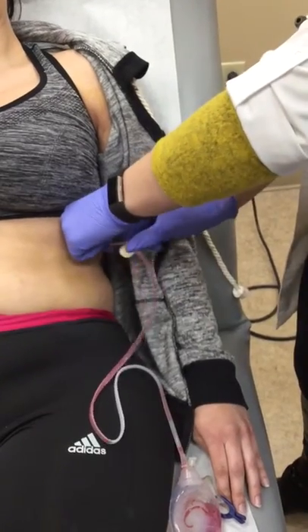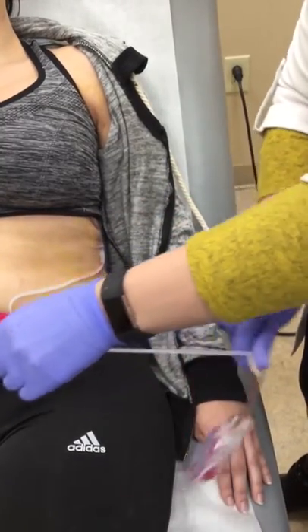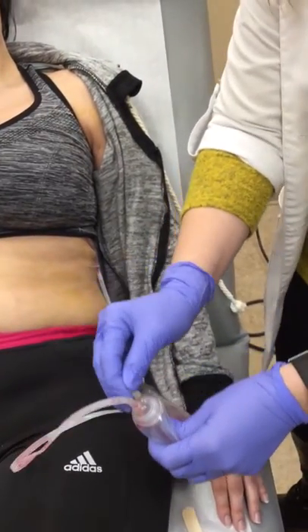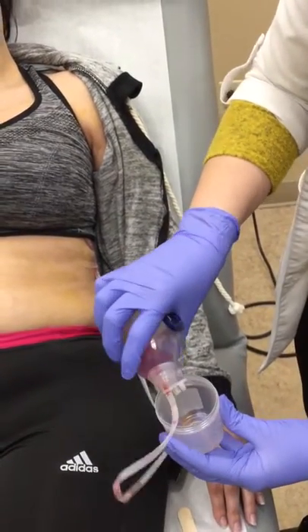I'll do that one more time. Now what you want to do is open the top of the JP drain by holding it up like this. Take your drainage container and puff it gently into the cup.